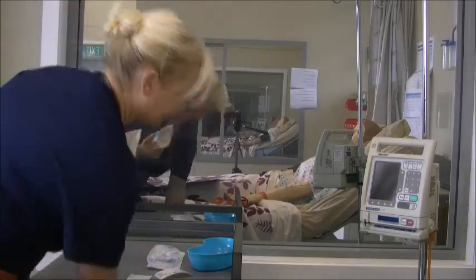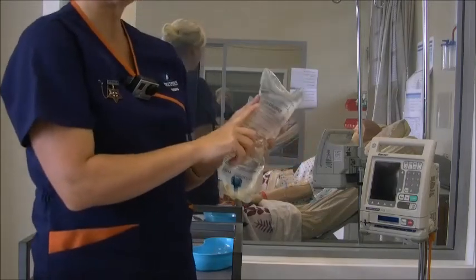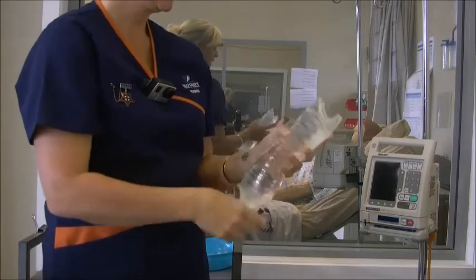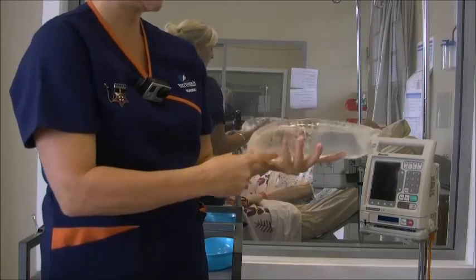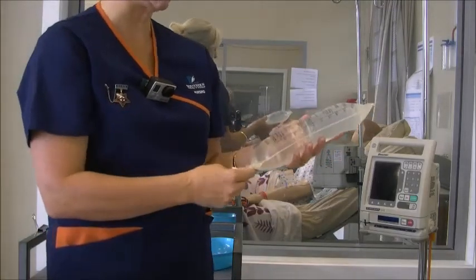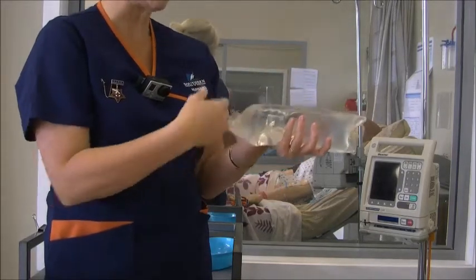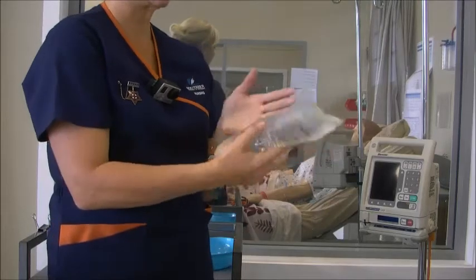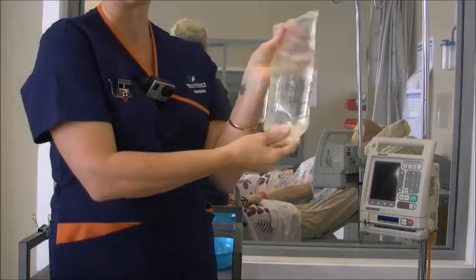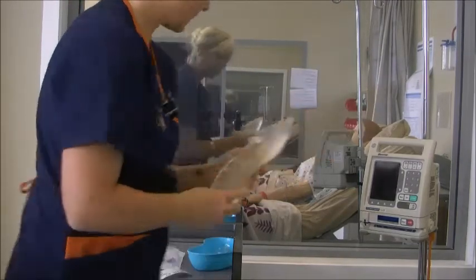I'm going to discard that down there. When I get my bag of saline, I'm going to check what it is. So this is 0.9% of sodium chloride, which I know is normal saline. I know that it's 1,000 mils, and I know that it's in date. So this one says December 15, so it expires at the end of the year. I'm also going to give it a wee squeeze just to make sure there's no holes or the plastic hasn't been deteriorating at all, and I'm going to look into the bag and make sure there's no sediment or anything floating around in there. So I'm quite happy that this bag is safe to give.